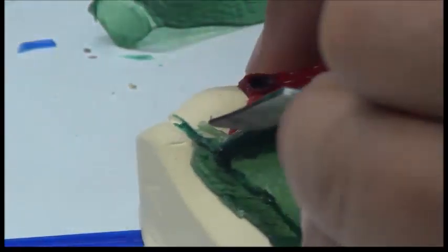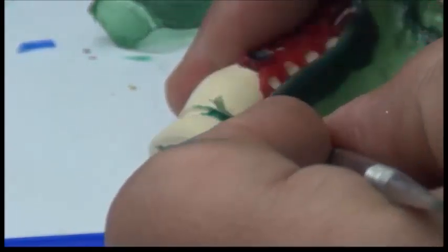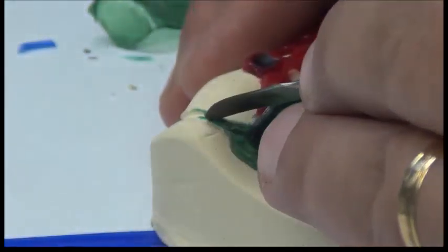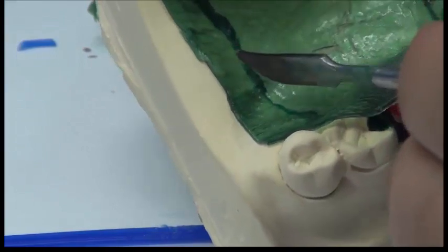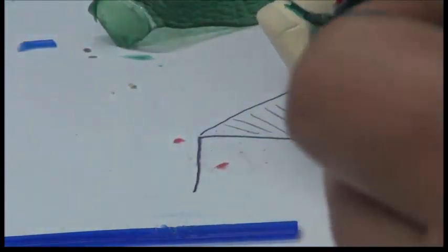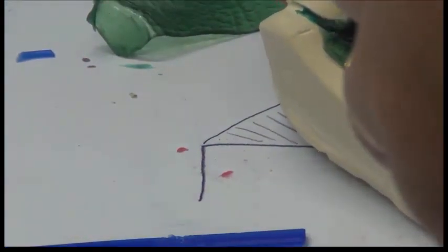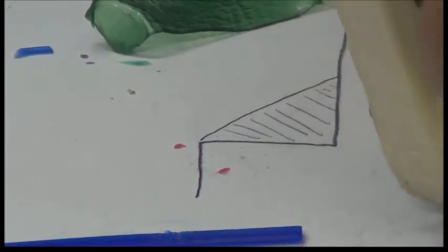In the beading line area, so let's say on the tuberosity area, the major connector does not go over the tuberosity. It reaches up to the hamular notch area. And we're leaving a triangle entering into the hamular notch area. Now the bead line. You can see that the wax, you can see through it. So where am I going to cut in the beading line? Put more posterior to it. So the beading line is now under the major connector.